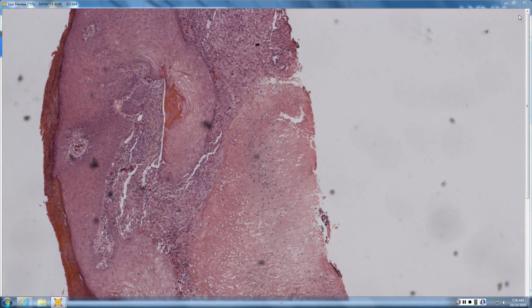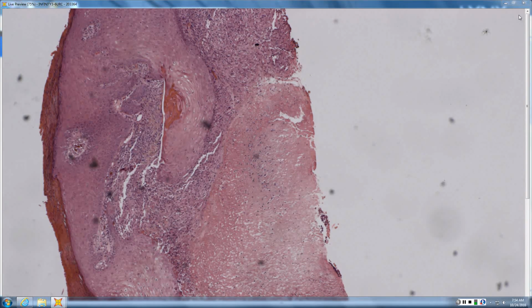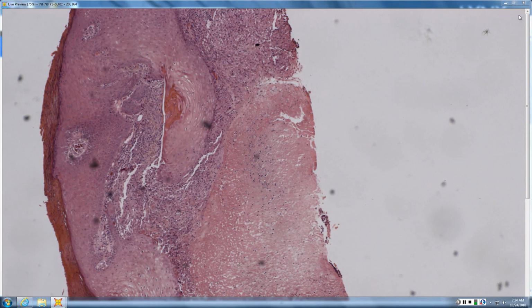So it is necrosis. In fact, it's caseous necrosis, right? So caseous necrosis, and surrounding that caseous necrosis are giant cells and a little bit of granuloma surrounding that. So I'd be concerned about TB, but it could also be LMDF. LMDF, you are correct. Very nicely done, and that's basically your top differential.